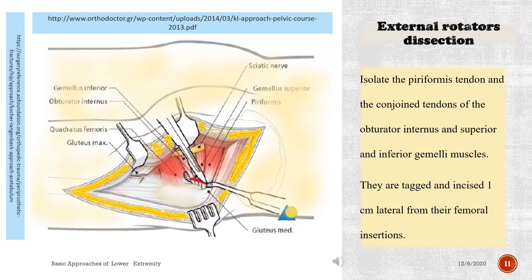External rotators dissection: isolate the piriformis tendon and the conjoined tendons of the obturator internus and superior and inferior gemelli muscles. They are tagged and incised one centimeter lateral from their femoral insertions.